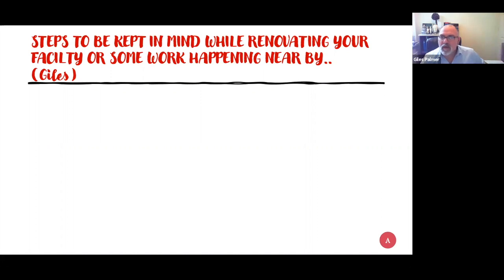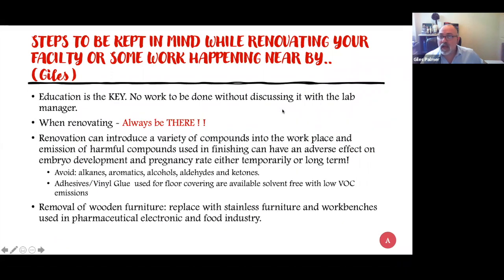A lot of this has been said before, so I will be very brief, because when you're renovating, it should be the same as the materials I described for starting up a lab. But the question does say, of course, if something else is happening near the lab. Well, education is the key. In my previous hospital, everyone knew they couldn't open a paint pot without first telling the IVF unit, and they take their measures. So education in the facility is key.